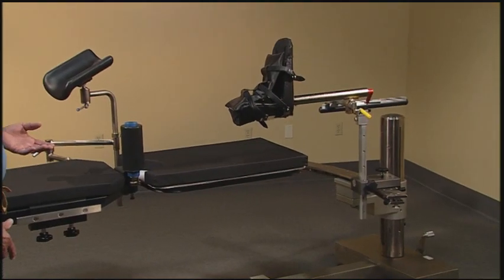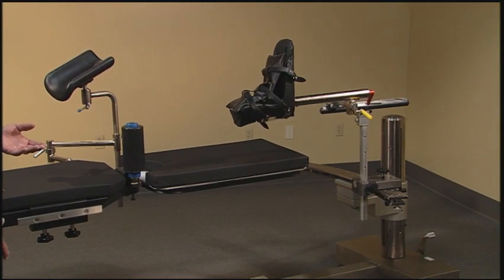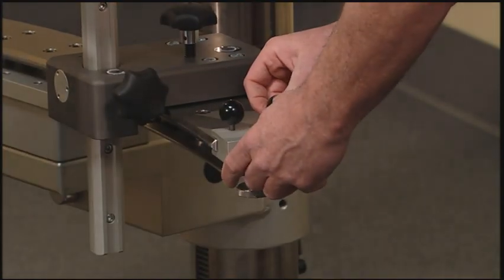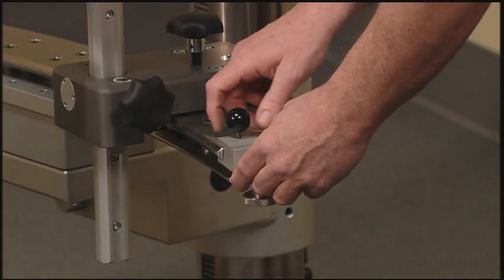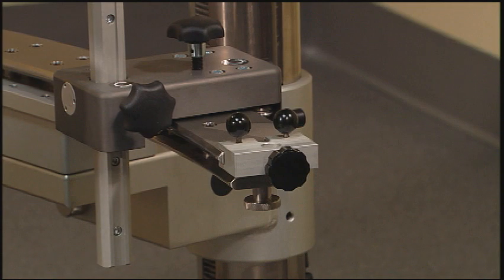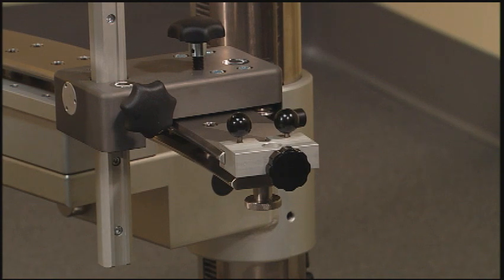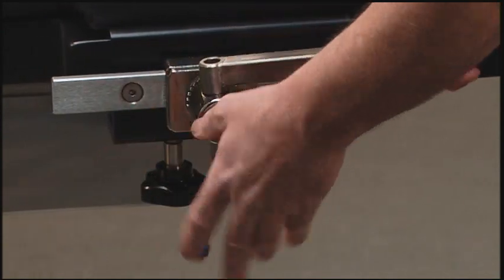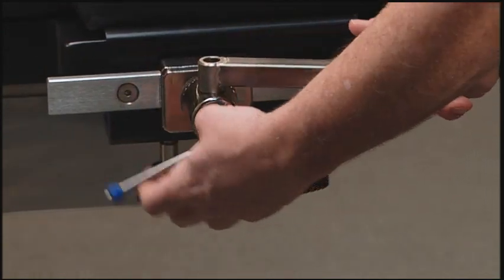The final step in assembling the table for supine femur and supine hip repair is to attach the drape rods. Using the bracket, attach to the end of the traction arc. Using a second side rail socket, attach it to the head end of the table. Into the side rail socket and also into the foot end bracket, attach a drape adapter.